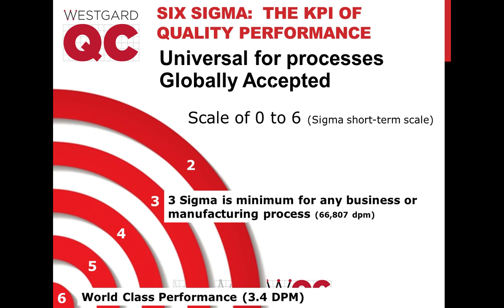Now, getting back to the specific question, there's a regulatory answer to this question, and then there is a best practice answer to this question. So with waived instruments, theoretically, the FDA has made a determination that no harm can come from the use of these results, and therefore the only thing that the user has to do is follow the manufacturer's directions. And the manufacturer may just say, put your limits at this set, X and Y, and run 3 controls and 3 external controls, maybe once a week, once a month, or something like that, and you will be in compliance, but you may not be doing best practice at all.